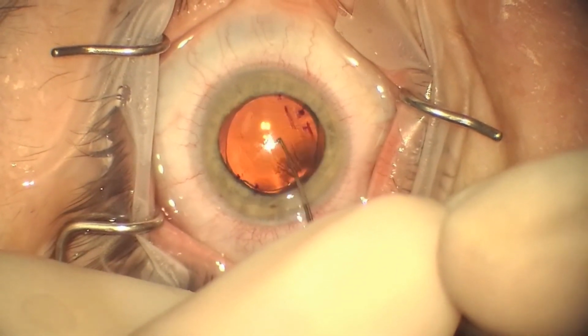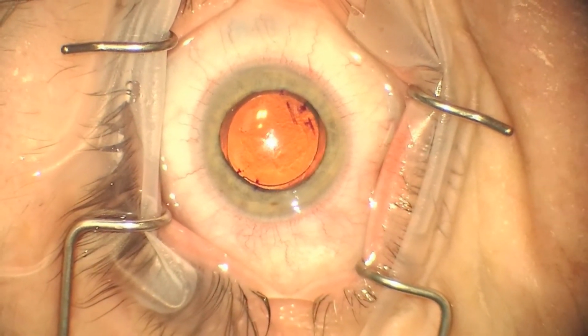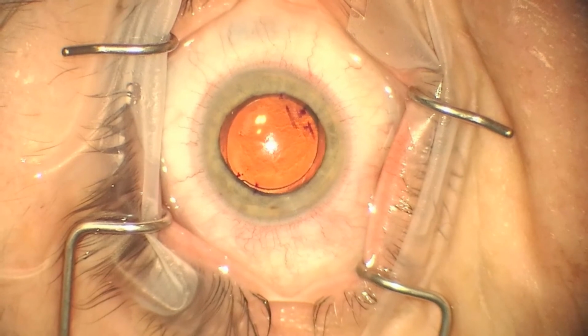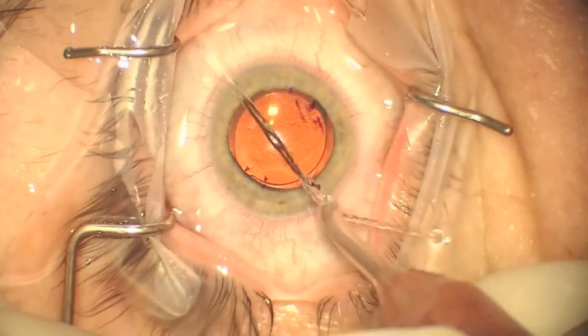I prefer to rotate in the clockwise direction because it's a bit easier to rotate, and now you can see that the alignment marks on the IOL are consistent with the ink marks on the cornea, and we're in good position.